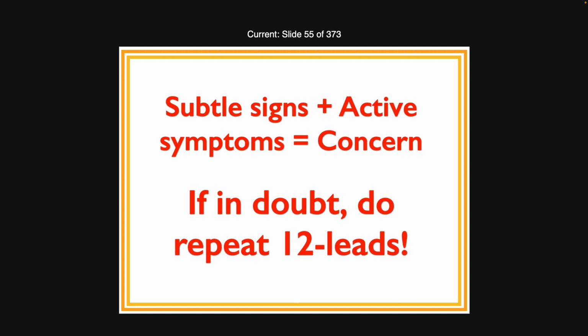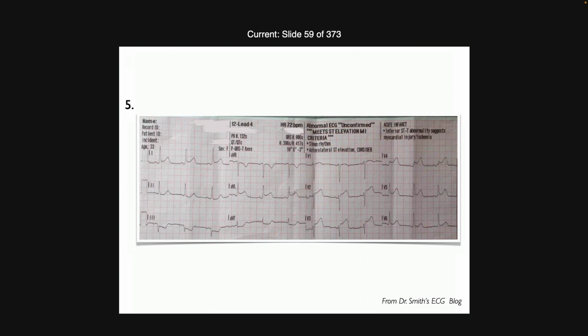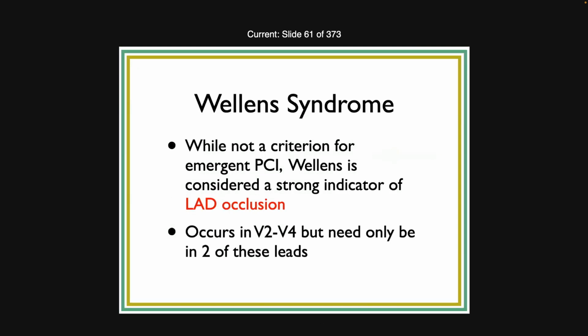I had a patient in their 20s, probably 2 or 3 weeks ago, that had a biphasic T in just lead 2. It's just lead 2? Yeah, it's just wonky. Okay, good enough for me, just wonky. Sorry, I seem to have lost my way here.